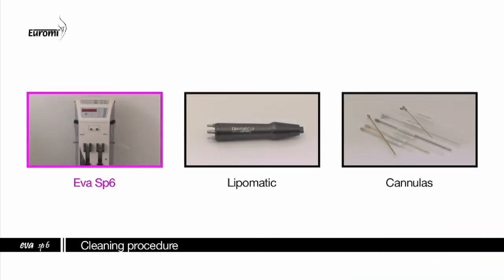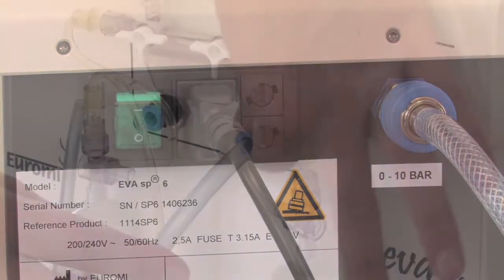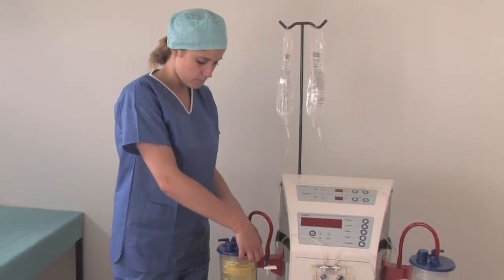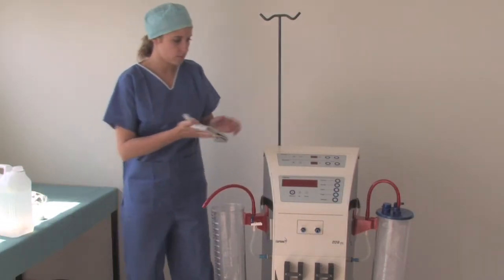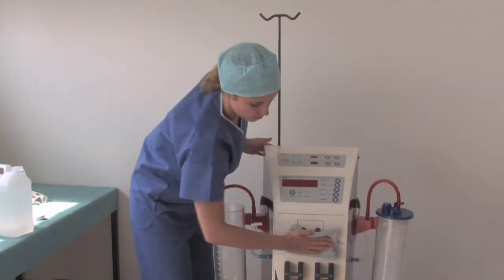EVA SP6 cleaning. Switch the system off. Remove and dispose of all disposables in an appropriate bin. Clean the surface of the EVA SP6 with a disinfectant dampened cloth. Clean machine must not be sterilized.